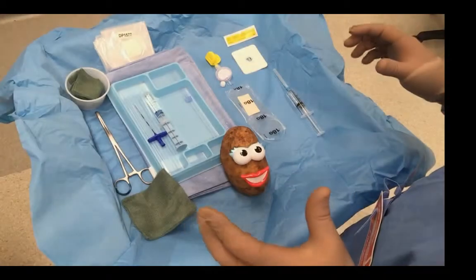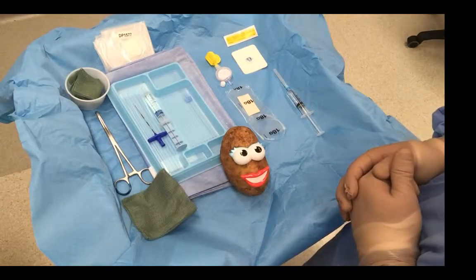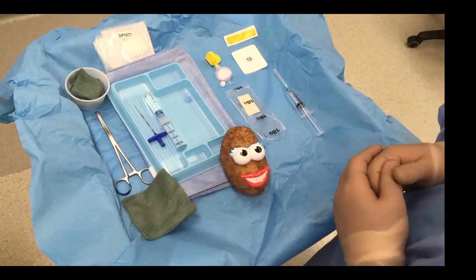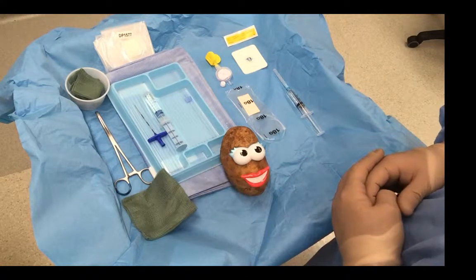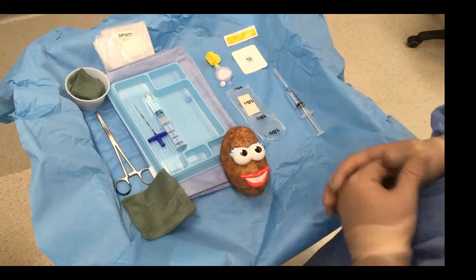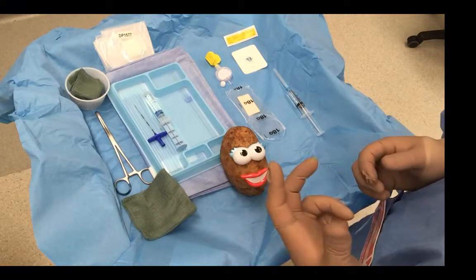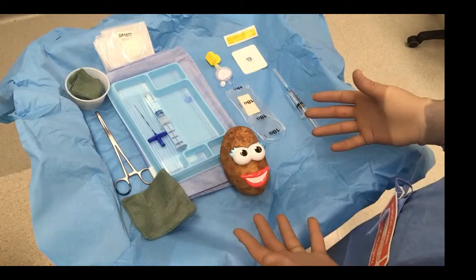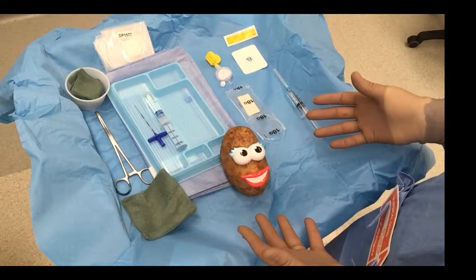So, we've got our tray ready, and this is where we're going to demonstrate the epidural potato, which is essentially an extremely low fidelity model to demonstrate to a novice practitioner the loss of resistance technique and how we can achieve that. This is our patient, Mrs. Potato, who we're meeting for the first time.